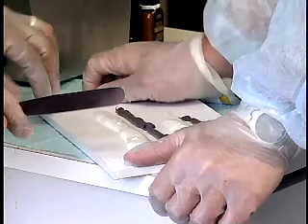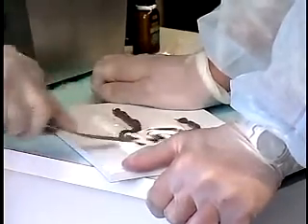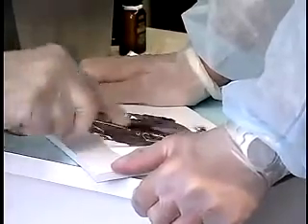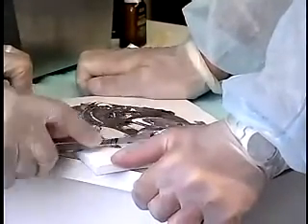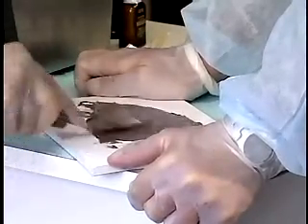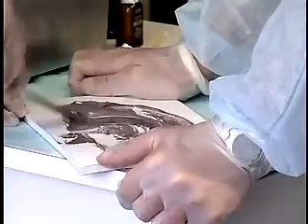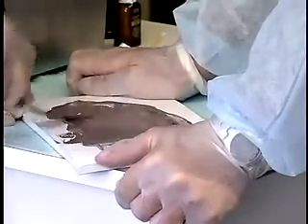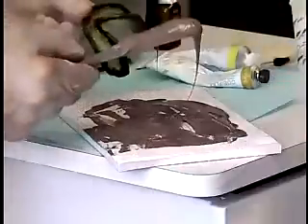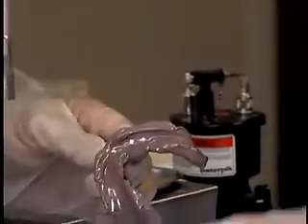Place equal 4-inch lengths of light body rubber base catalyst and base on the mixing pad. Mix until homogeneous. Distribute the material uniformly in the tray using a small cement spatula. Cover the borders 2 to 3 mm onto the labial and buccal surface of the tray.